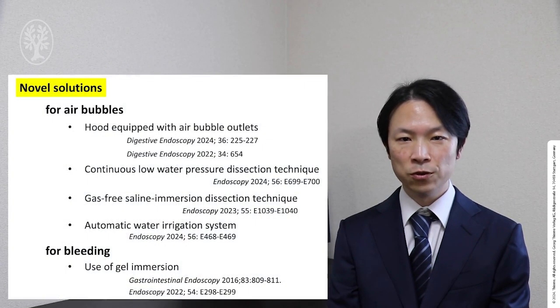Novel solutions for air bubble removal have recently been reported, such as a hood with air bubble outlets, continuous low water pressure dissection technique, gas-free saline immersion dissection technique, and automatic water irrigation system. Moreover, the use of gel immersion may facilitate the management of bleeding. However, these solutions need to be validated in further studies.